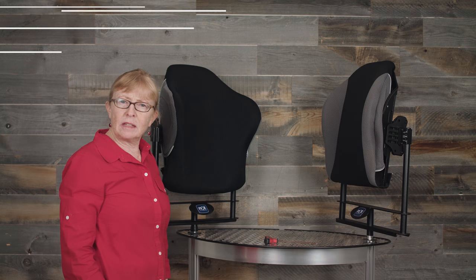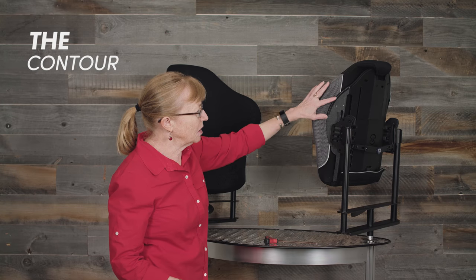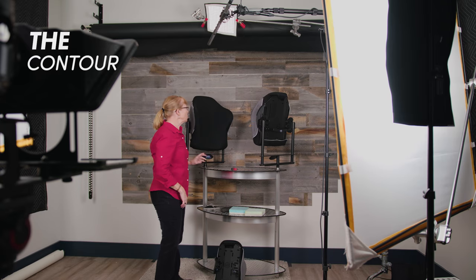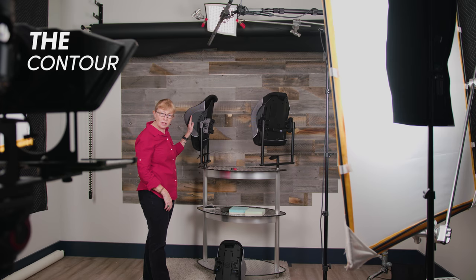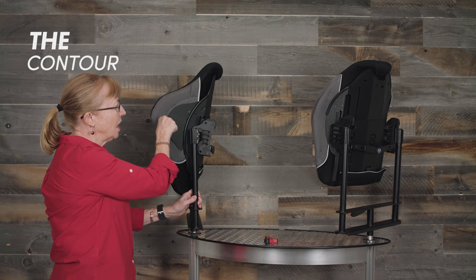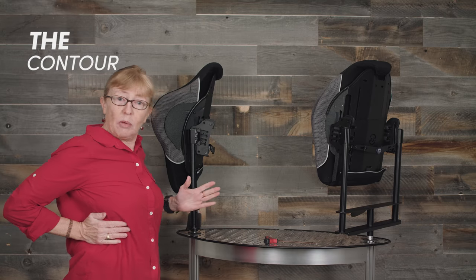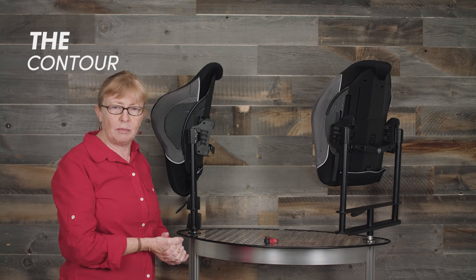The Xtend comes with a standard contour — I've removed the cover already so you can see — the contour is three and a half inches in depth. It also comes in the deep version, the Xtend contour deep, which comes in five and a half to seven inches in depth. It is adjustable as well; I've already loosened the bolts here so you can change the depth of the contour — maybe on one side it's deeper than the other, or you can adjust it for your client as needed.